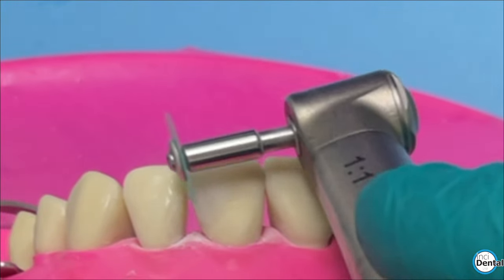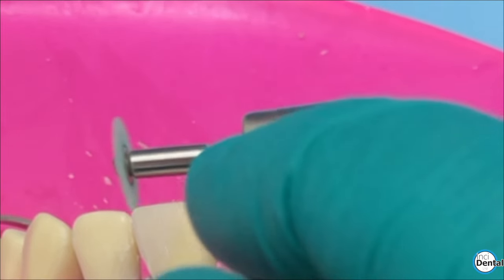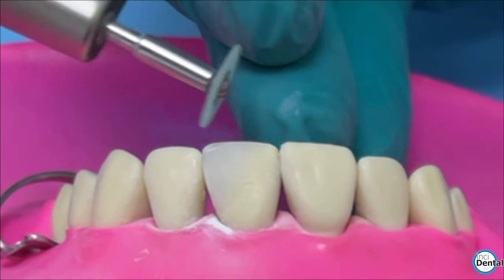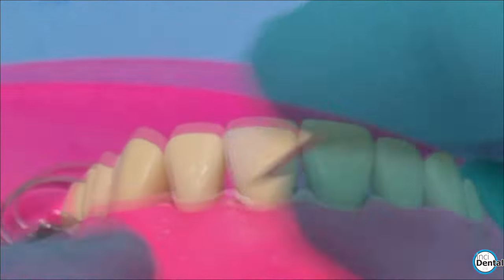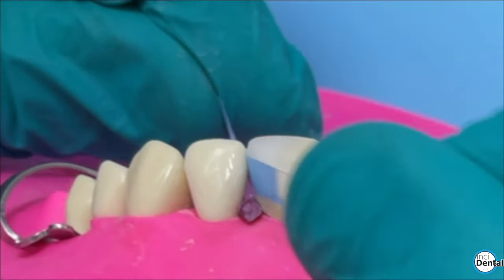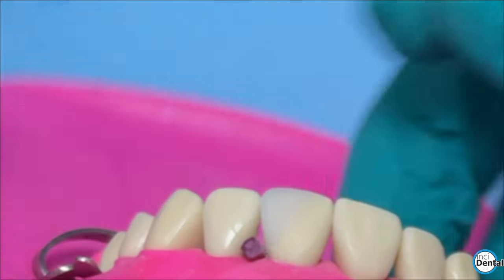This next bit I find most stressful: doing the incisal corners. If you take too much too quickly it can really ruin the look of the tooth. So I'm using the green disc again for a little more control at very slow speed, just trying to roll that distal edge of the tooth to be nice and curved and match the shape of the adjacent tooth. The next step is to polish the proximal surface. Wedging it firmly helps prevent losing the contact point. Using Torviem polishing strips, wrap around the tooth and do one edge at a time, pulling across — that way you don't flatten and round it all off.